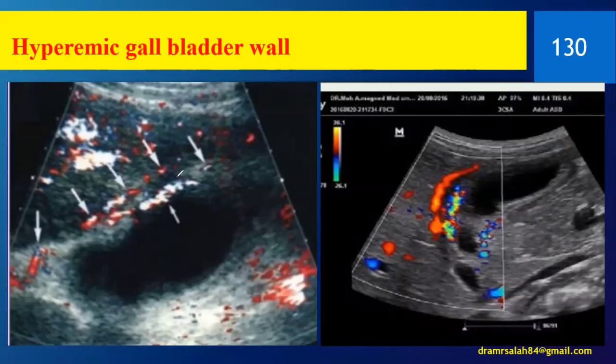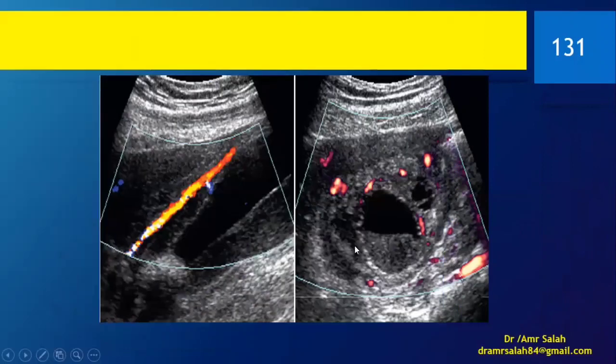Now, this is the clinical importance of finding it and adjusting your Doppler settings in order to see it. As we see here, this is the anterior branch of the cystic artery and it's hyperemic. Again, the same here. This also confirms the presence of a hyperemic, hypervascular state, suggestive of acute cholecystitis. Look at this, where the stone is impacted. We have this hypervascularity, the thickening of the gallbladder, and the pericholecystic fluid that has formed small abscesses. All of this strongly suggests acute cholecystitis.